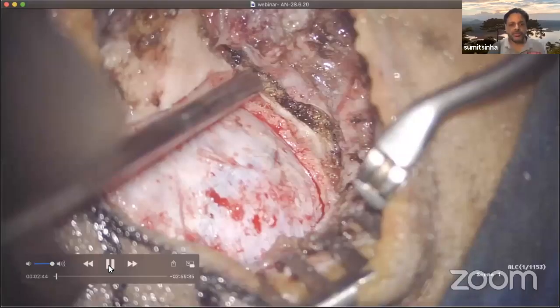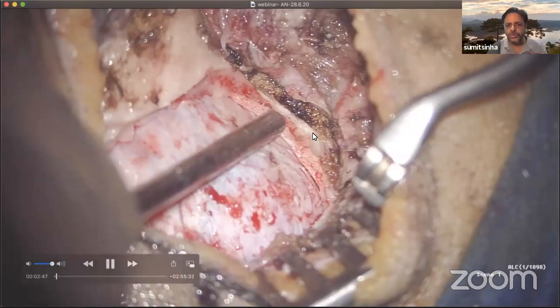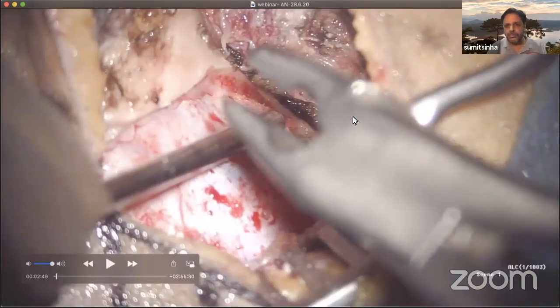Proceeding forwards, now this is how it looks when you first remove the bone flap. Let me orient you first. This is inferior, towards the patient's leg. This is cranial. This is the patient's right side. And this is towards the floor, the patient's left side. This is towards the floor. This is towards the sky. This is cranial, and this is caudal. Is everyone clear about it?